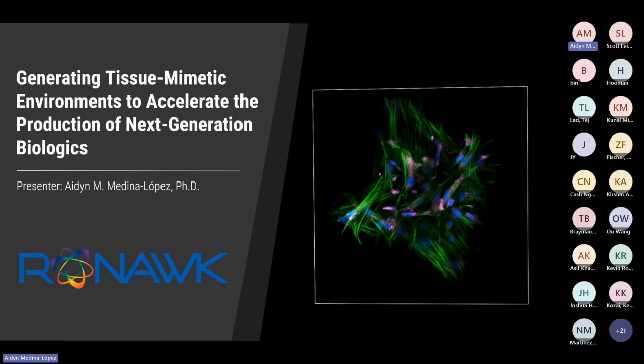For that particular experiment, cells were extracted from the bioblock, and the staining was done in a plate. That was the decision to do that. It was so we treated all of our cells the same way, because the cells that were cultured in the matrigel needed to get extracted from the matrigel, and the cells cultured in spheroids needed to get dissociated. So we also decided to take out the cells of the bioblock.